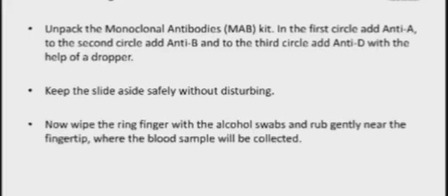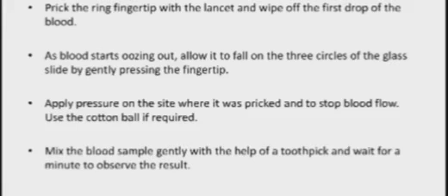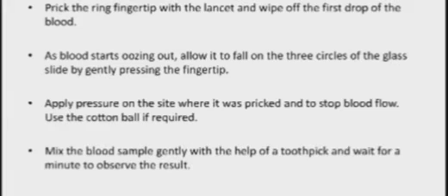Wipe your ring finger with the alcohol swab and rub gently near the fingertip so that blood flow increases to the fingertip and a blood sample can be collected. After rubbing, prick the ring finger with the lancet and wipe out the first drop of blood — discard it. As blood starts oozing out, allow it to fall on the three circles — the A circle, B circle, and D circle — by gently pressing your fingertip. Apply pressure to stop the blood flow; if it is not stopping, use a cotton ball.